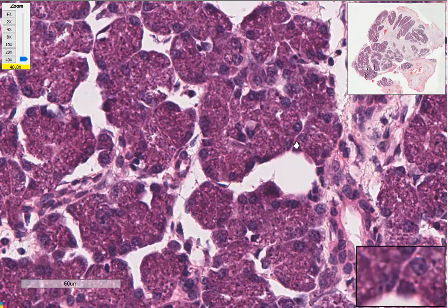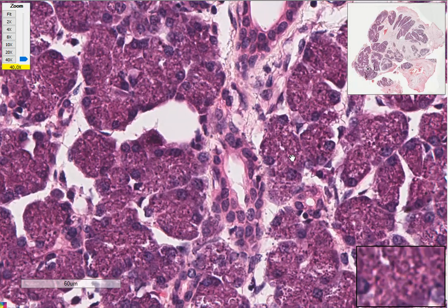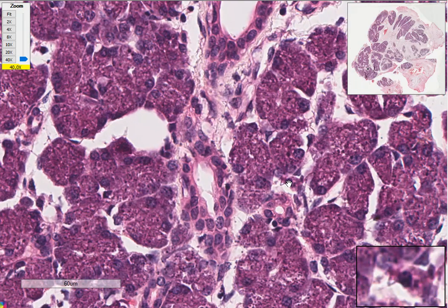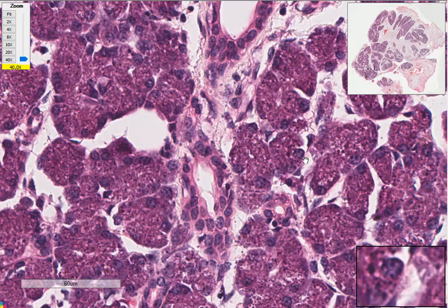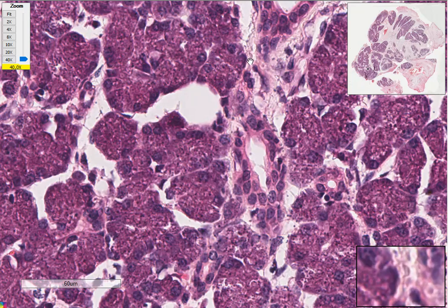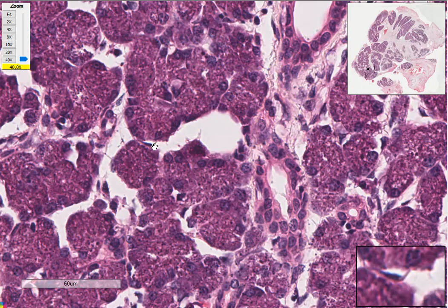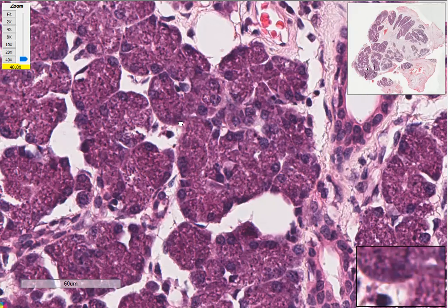If we had to stain them with immunohistochemical stains, they would stain with P63, P40, calponin, SMA, that's smooth muscle actin, and also smooth muscle myosin heavy chain. If you want to push it further, you can also use CK5 or WT1. Those are some immunohistochemical techniques if you really want to stain for the myoepithelial cells of the salivary glands to properly appreciate them.